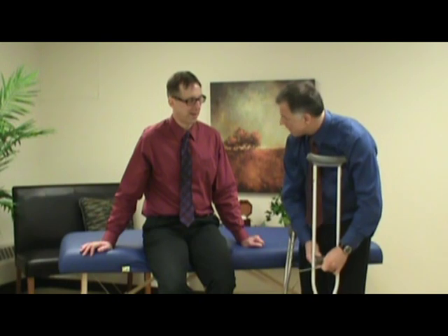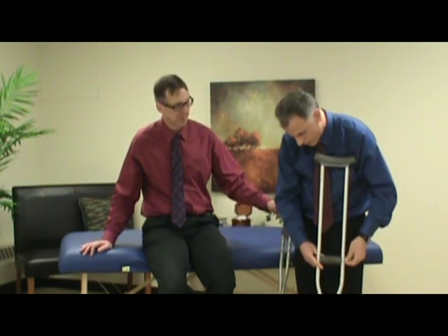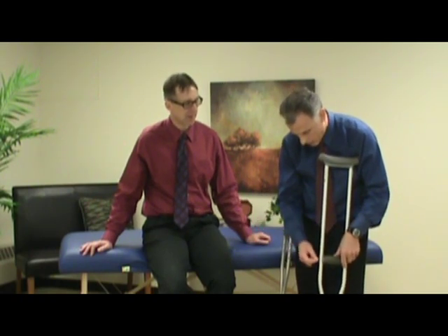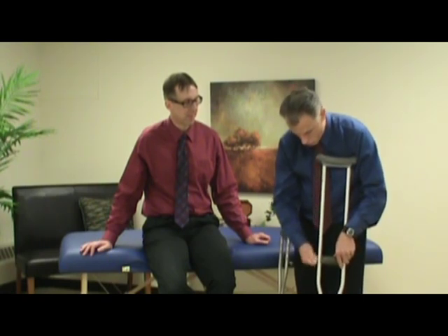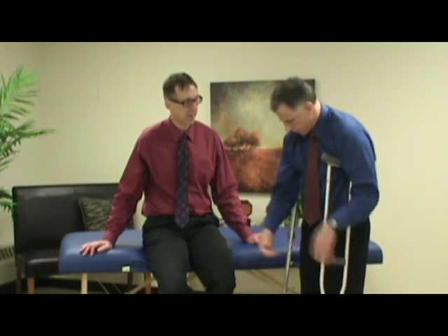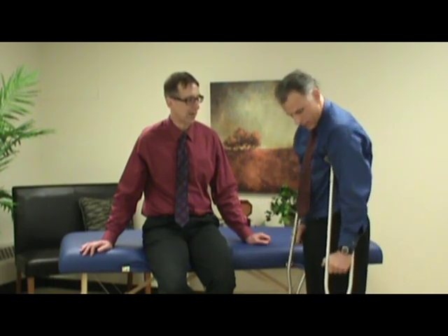So then, did you find the right spot now? Well, I don't know, Bob, where I am. There's a little nylon washer. It's nice to keep that in there. It works a little bit better with that. And you simply tighten it back up. You don't have to tighten this real snug, but make sure you get it snug enough so it doesn't come out. There, that feels good.